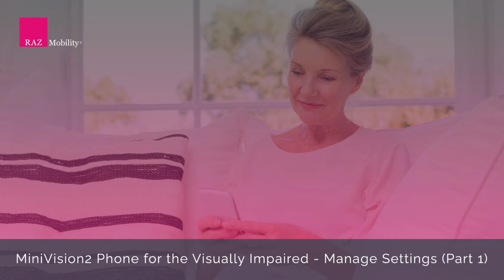So let's start from the top. The first one is display. This is where we'll find all of the settings for the display on the Minivision 2. So I'm going to press OK. Display. Brightness. So here's where you can set your brightness. All of this is accessible. Even though you may not be able to see, it's still accessible.